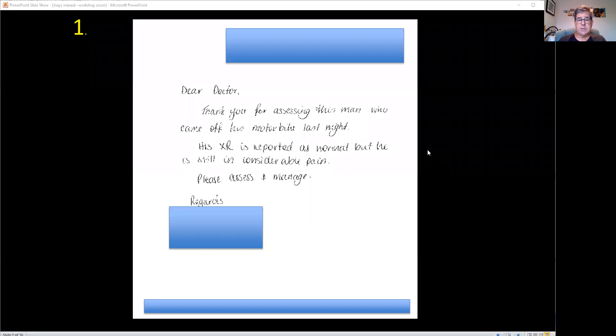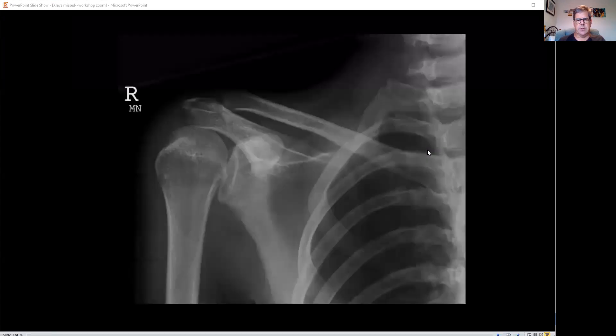This is a true letter that says: Dear Doctor, thank you for assessing this man who came off his motorbike last night. His x-ray is reported as normal, but he's still in considerable pain. Please assess and manage. So this is the x-ray that was done. He's in significant pain — so what do you think?